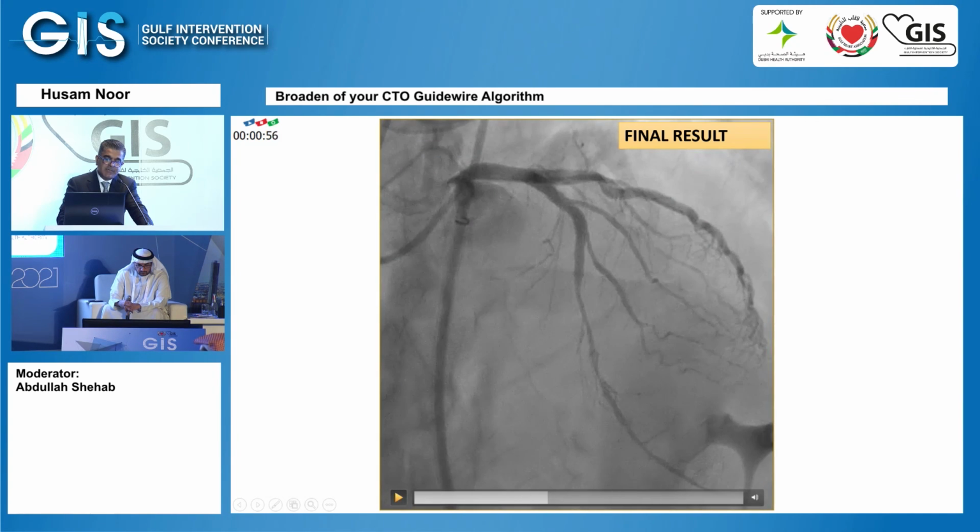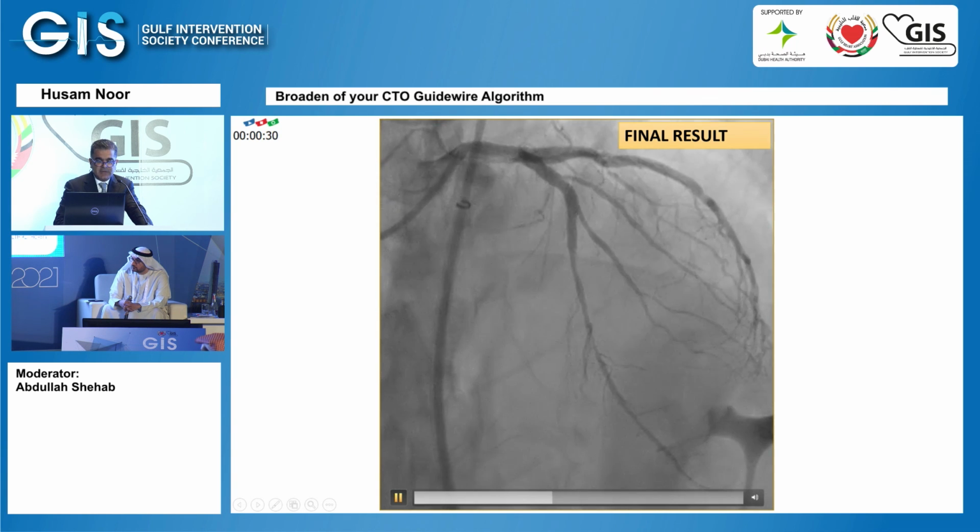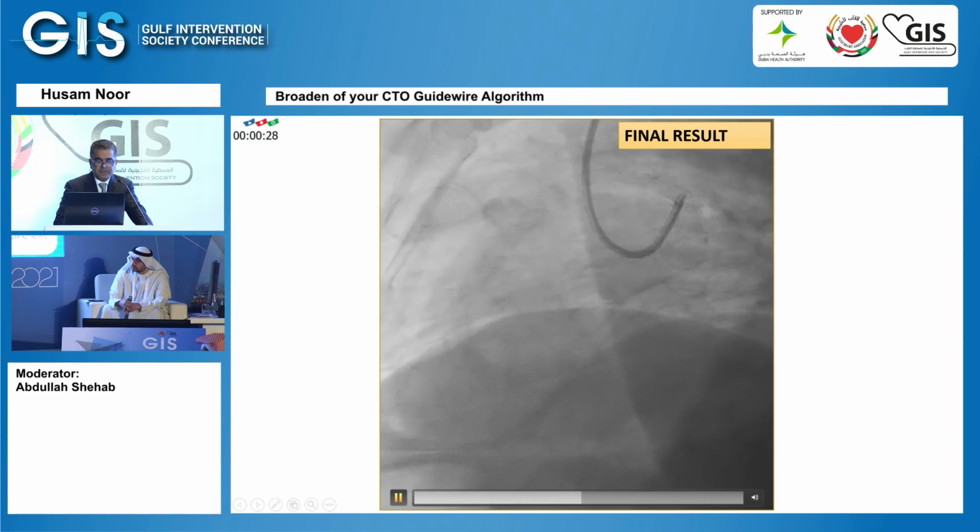I'm going to stop one second in here. If you look at this area, we actually IVUS'd it, and unfortunately I don't have it in here. It's all negatively remodeled. So you need to hold your temptation of stenting it. When we see something like this, our practice is to bring them back in about 2 months' time for a check angio and reassess the situation, because most of these would grow over time. And that was shown very clearly in the CONSISTENT CTO.